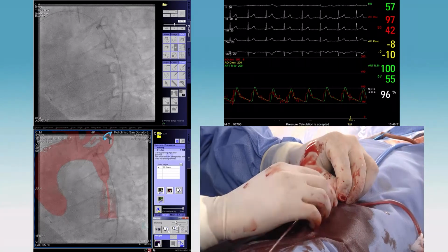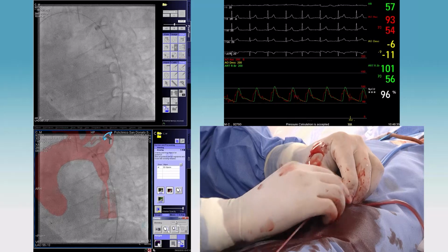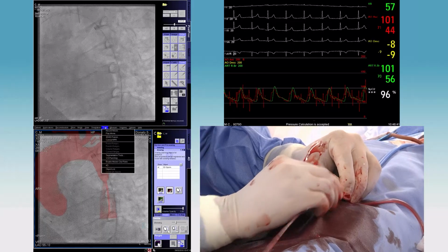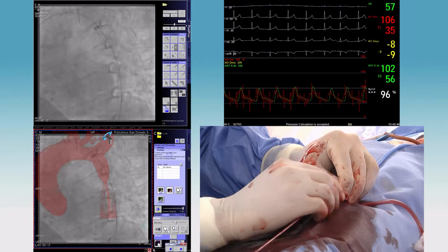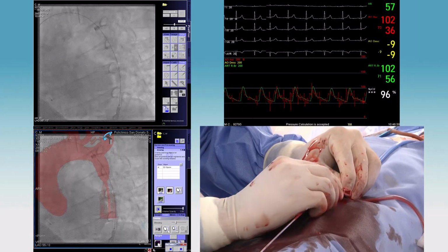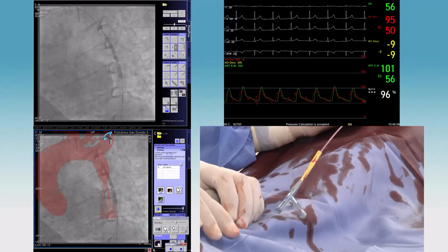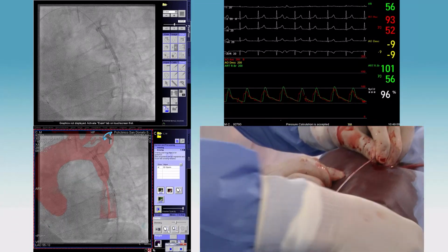Okay, so let's show you the stent going up, the sheath. By the way, the shaft is 120 length, which is important, obviously, because the other shaft on these is around 80. So what you don't want to do is use a 75 length Mullins sheath and then use the 80 length shaft, and then you won't come out of the end of the sheath.